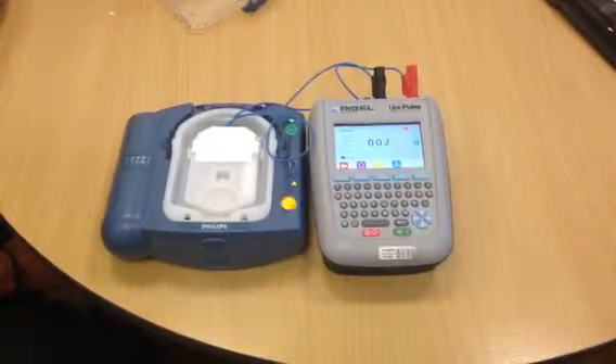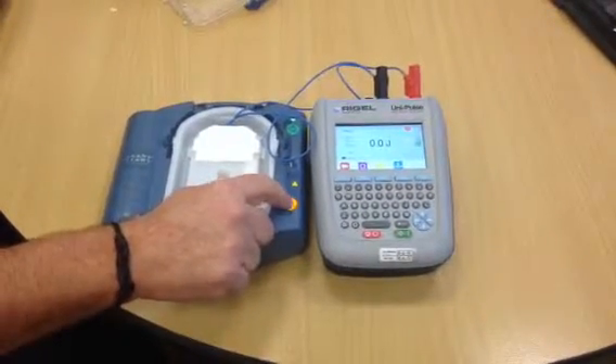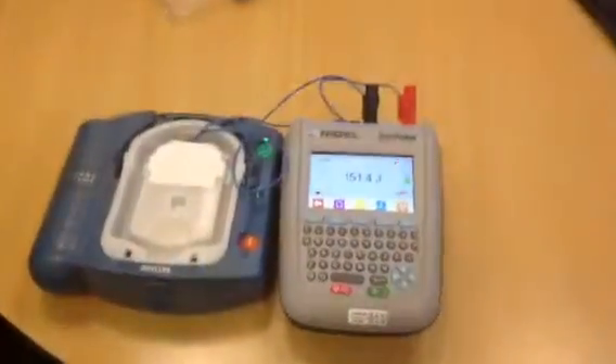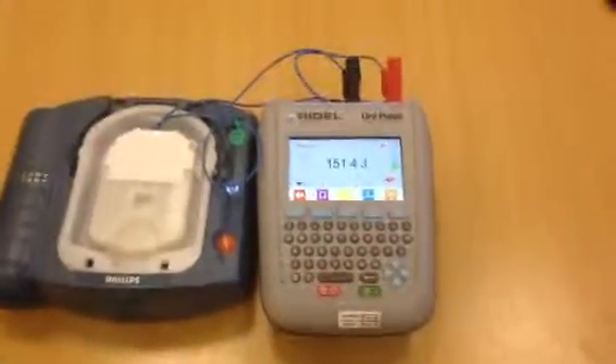Shock advised. Stay clear of the patient. Press the flashing orange button now. Shock delivered. Be sure the ambulance service has been called.